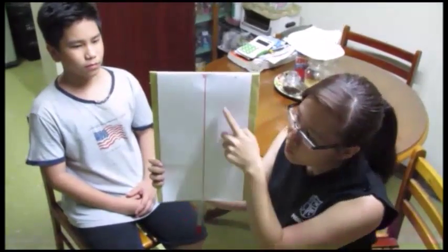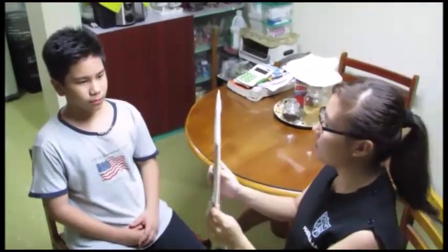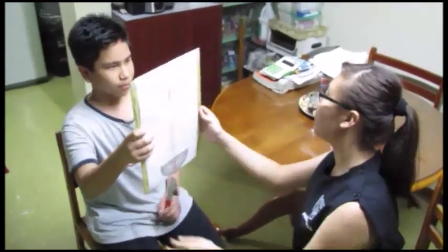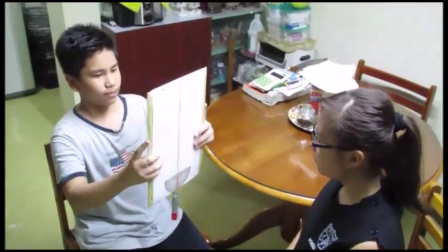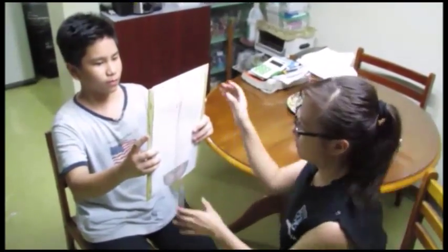So first, you have to ask the patient to align this luminous bar. Let that luminous bar be represented by this red line here to how they perceive it as vertical. So, Mr. Gemwell, please align this line or bar to how you perceive it as vertical. Hold it for 30 seconds. As the patient does that, the PT measures the degree of tilt from the vertical at the back of the SVV test device. So, thank you, sir.